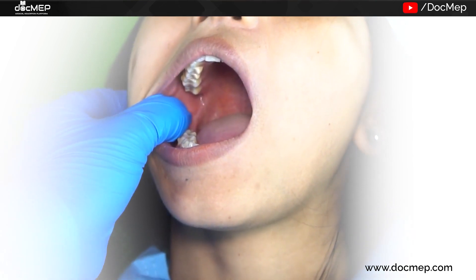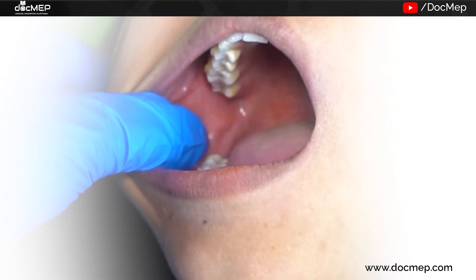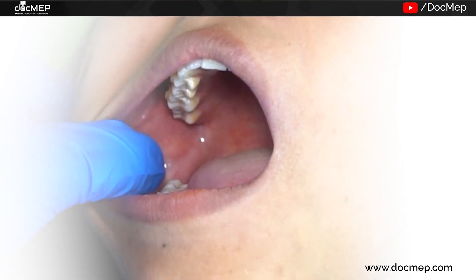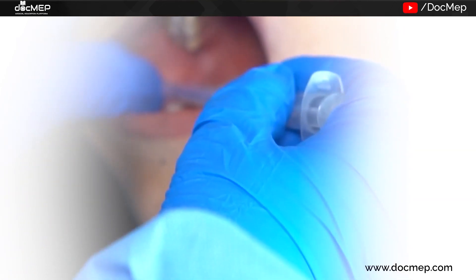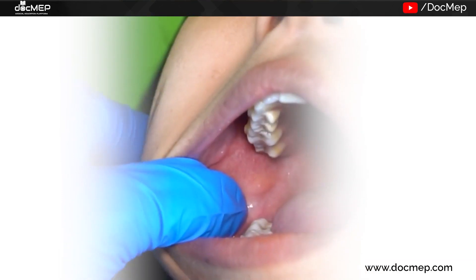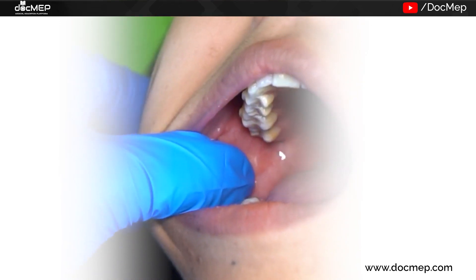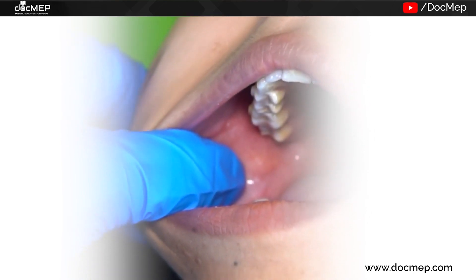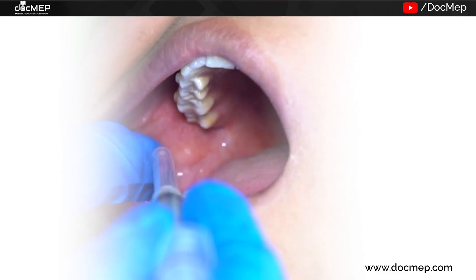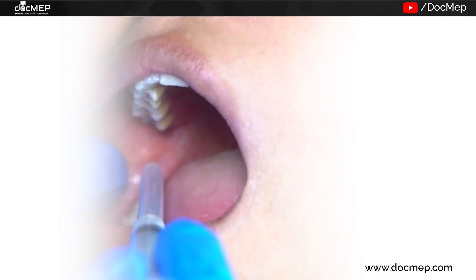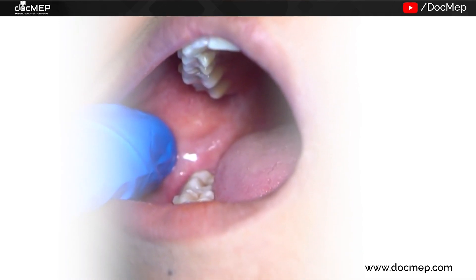The finger is moved up and down until the greatest depth of the anterior border of the ramus is identified. The coronoid notch is in direct line with the mandibular sulcus or the mandibular lingula on the inside. The palpating finger is then moved lingually across the retromolar trigon onto the internal oblique ridge and moved laterally, still holding at the level of the coronoid notch. The finger remains in line with the coronoid notch in contact with the internal oblique ridge, then moved to the buccal side, raking with it the buccal sucking pad. This gives better exposure to the internal oblique ridge, the pterygomandibular raphe, and the depression.